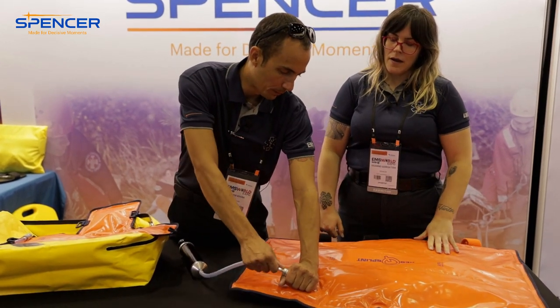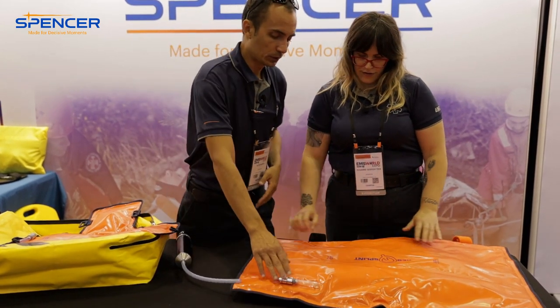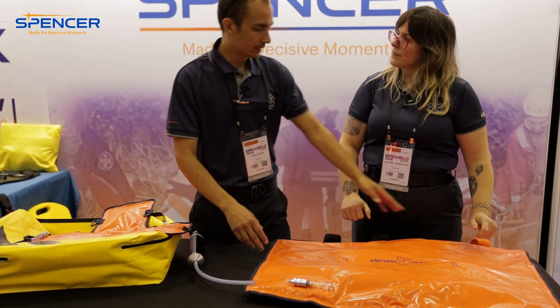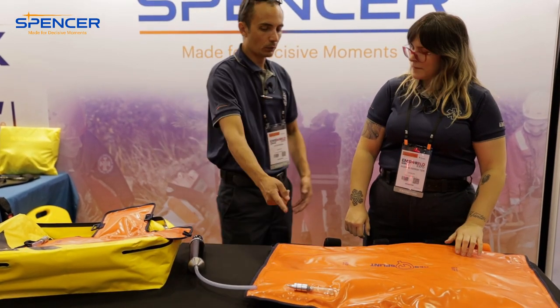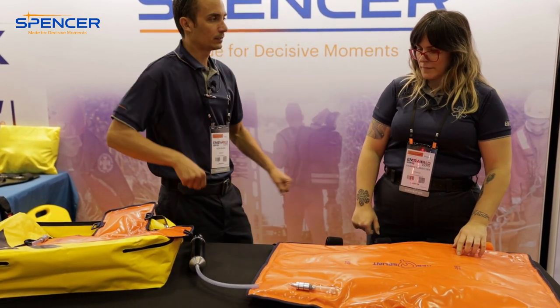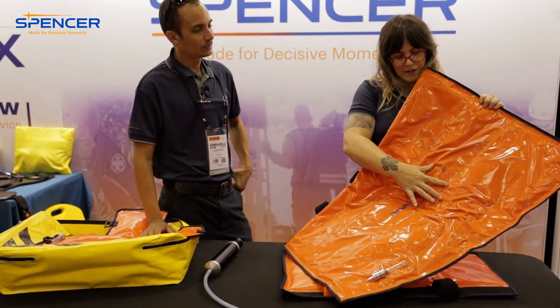When you're done, it's important to hold the valve before you pop it off — don't just tug at it. Also, you want to keep the orange at the top and the valve end at the bottom, so you don't end up placing it awkwardly, like up in somebody's crotch where you'd still need to attach it.